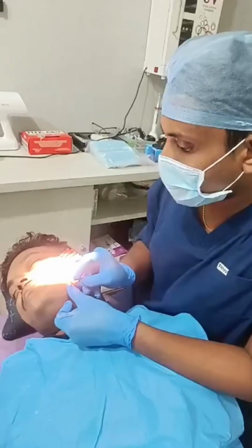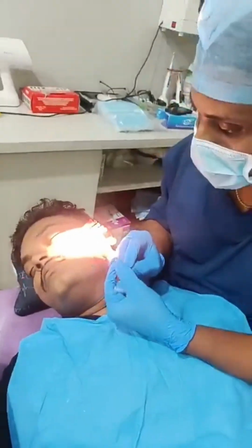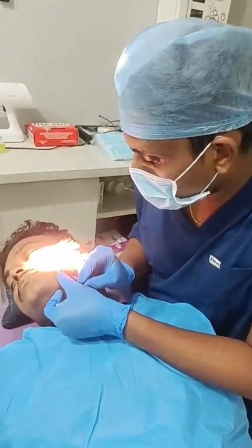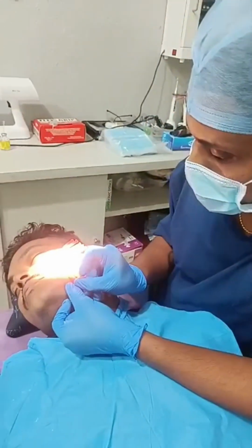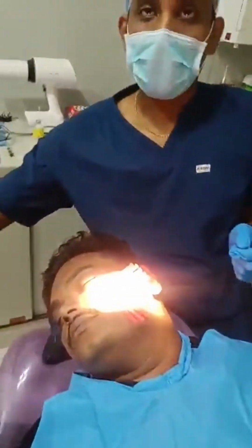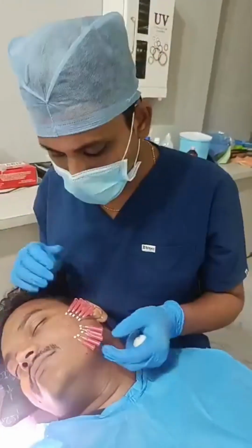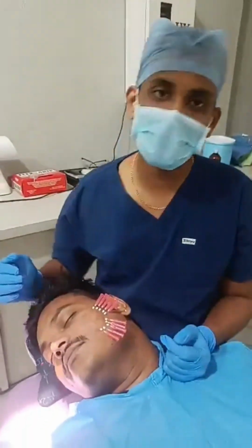Now can you see the bulb getting filled up slowly? The last one. After completion, almost 5 in this plane and 5 in this plane, it will be a cross hatch pattern which I have been mentioning.